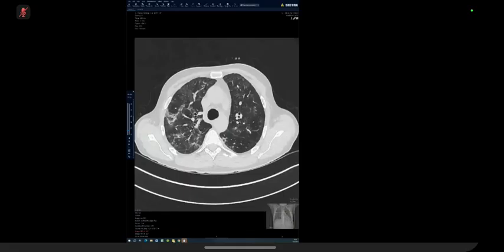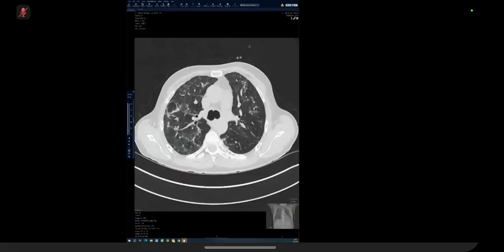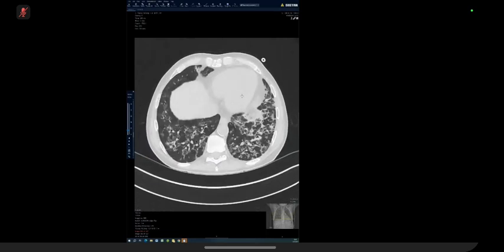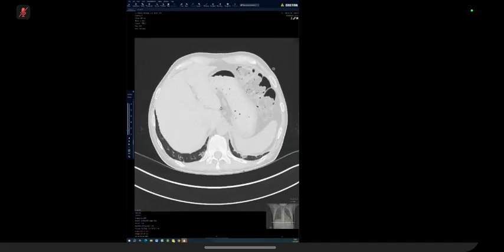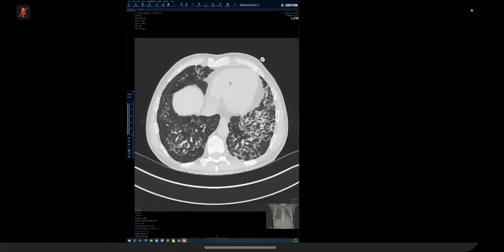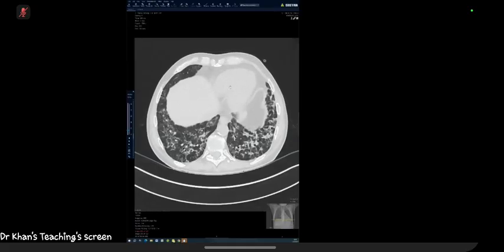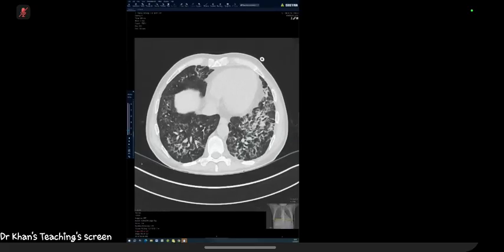And I would say, yes, the patient started nitrofurantoin 3 weeks ago, and 2 weeks ago their cough started. So this is actually a nitrofurantoin lung, and this is starting to fibrose. It's drug-induced interstitial pneumonia. Drug-induced, exactly. That's the diagnosis here. Okay, so I think we're running over. So thank you so much.